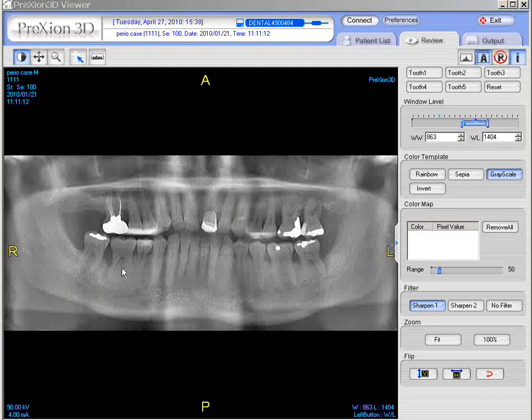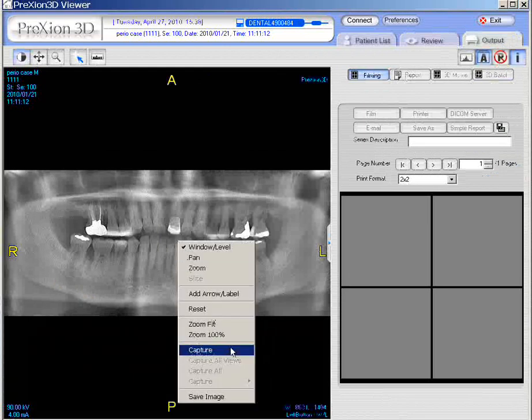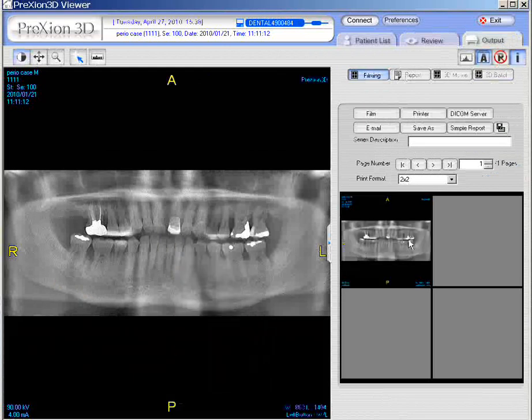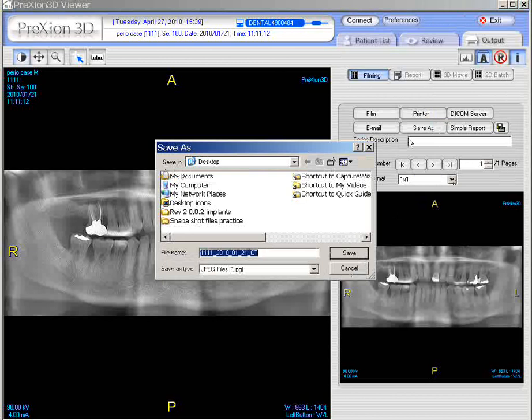You might hear a little click on the computer. Go to the output panel and let's capture it this way. Once you're in the output panel, however many images you have, you can select just the one-by-one format. You could go to Printer if you've got a printer hooked up, or you can go to Save As and save it as a JPEG file. Just rename it what you wish and send it to where you wish.